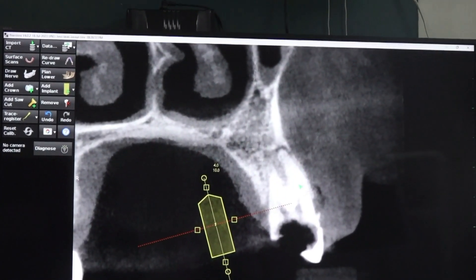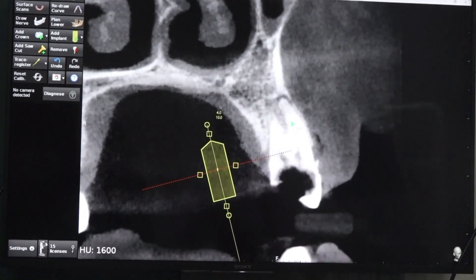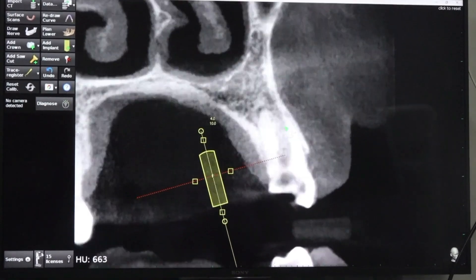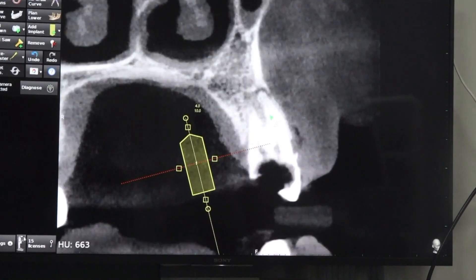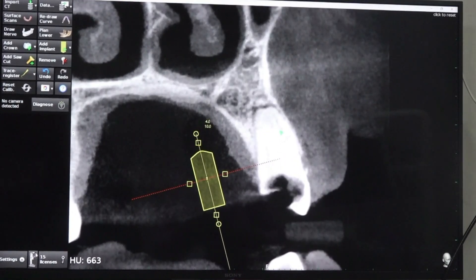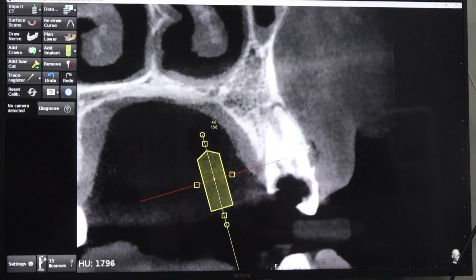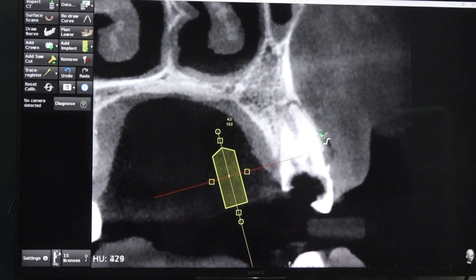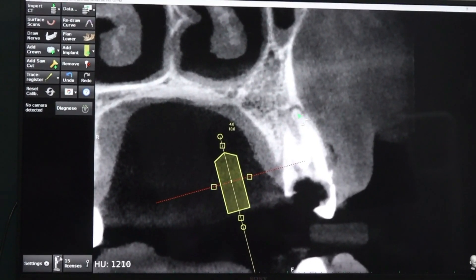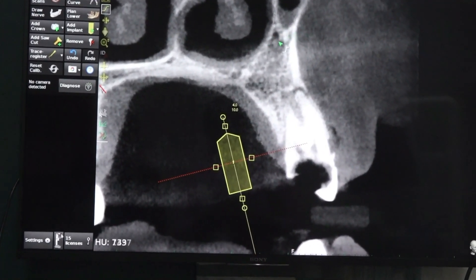Two roots, but the palatal root looks fused. In the mesial aspect only, visually it is slightly separated. The buccal root, as usual, is close to the labial plate, so we should do the extraction very carefully not to break this plate.